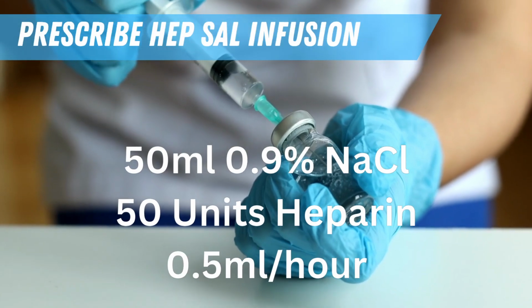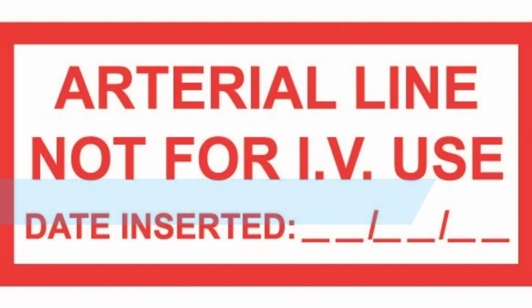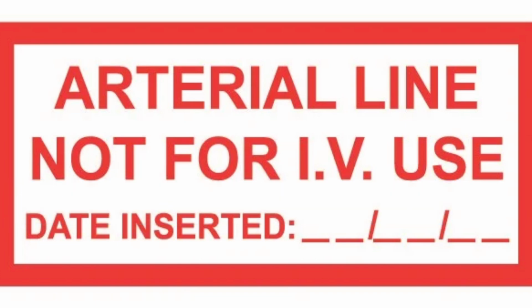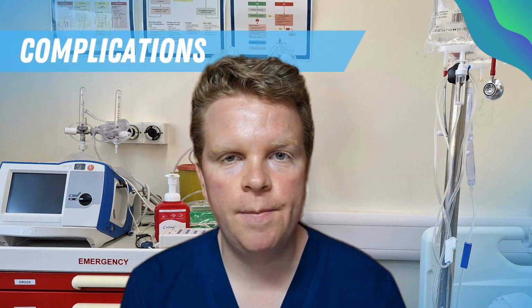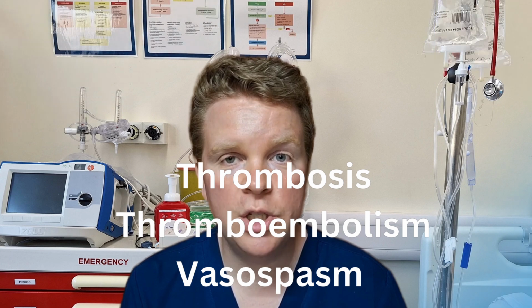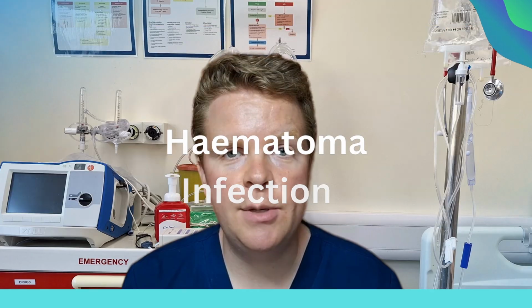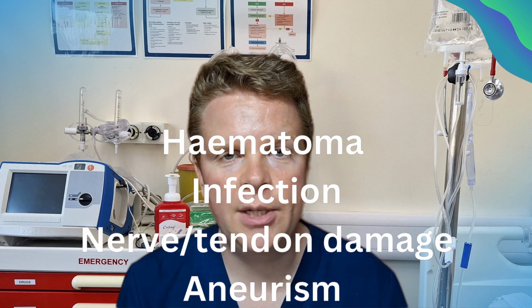Make sure you prescribe a heparinized saline infusion to avoid blood clots developing in the arterial line. Always make sure the arterial line is appropriately labelled to avoid accidental injection of fluid or medication. This procedure has a number of complications and should only be performed after senior discussion. The main complications are thrombosis, thromboembolism and vasospasm, which can lead to necrosis, gangrene and autoamputation of the extremities. A large hematoma, infection, local aneurysm, tendon or nerve damage can occur.